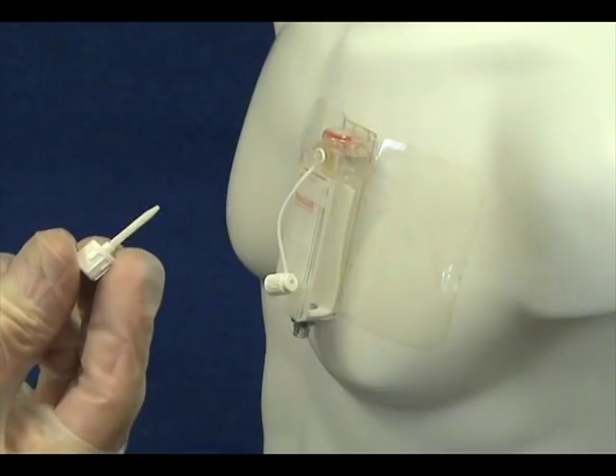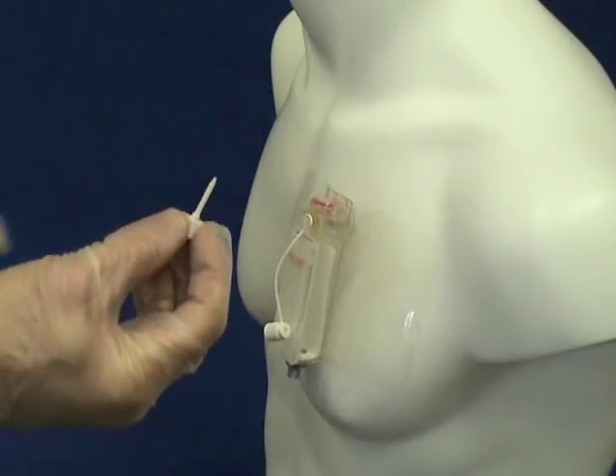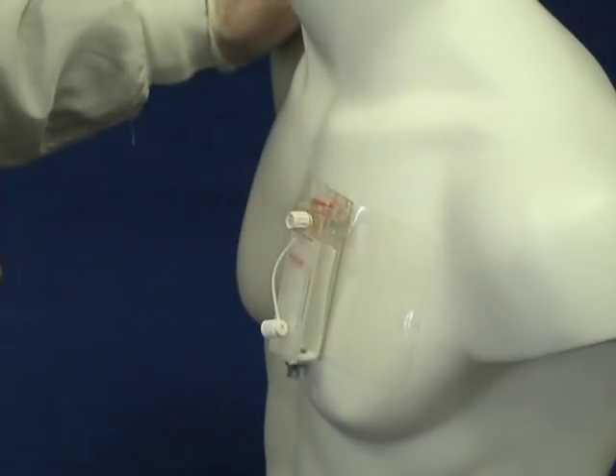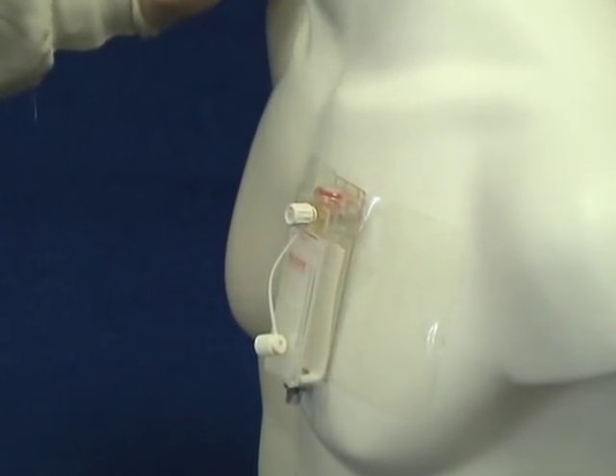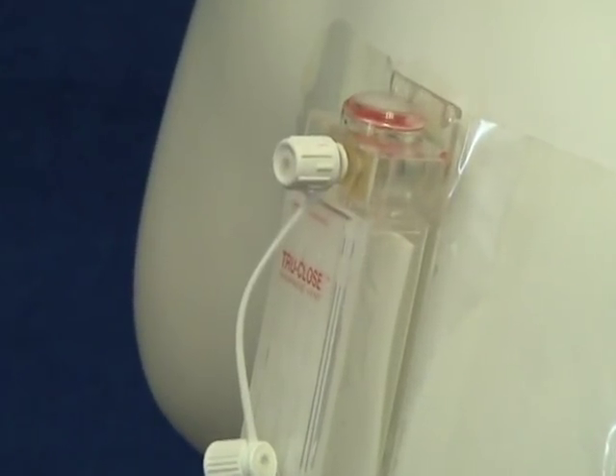The thoracic vent occlusion plug can be used to check for a continuous air leak from the patient's lung. To occlude the thoracic vent, insert and secure the occlusion plug to the luer lock on the self-sealing port. Once the physician determines that there is no continuous air leak present, a radiograph can be used to confirm resolution of the pneumothorax and the vent can be removed.